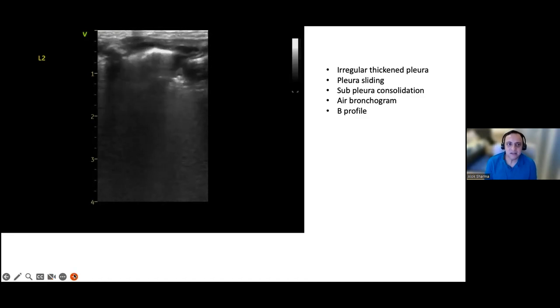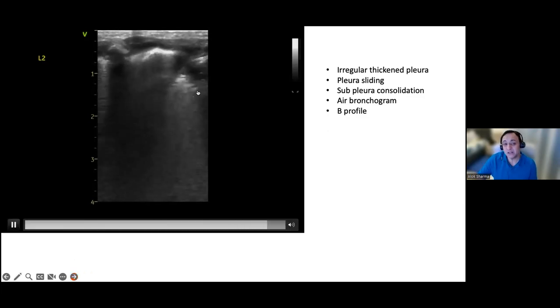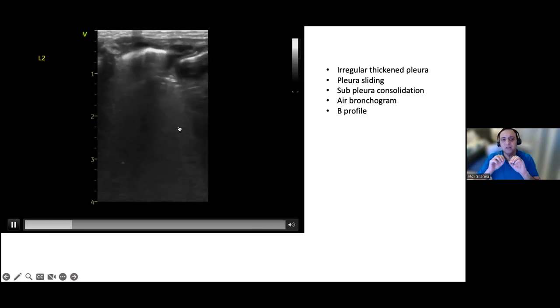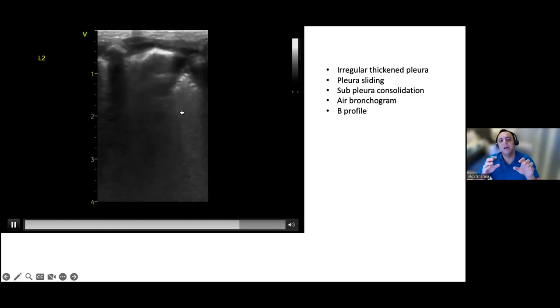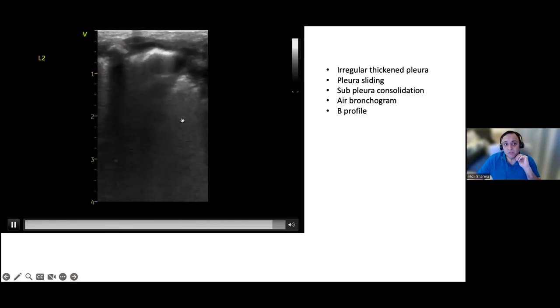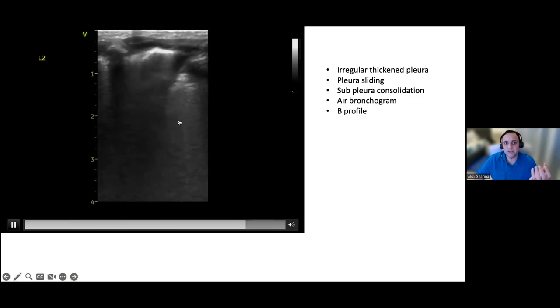Pleural sliding present, but I just think a little bit of lung pulse that you see there. And that's where you'd actually see the shadow of the heart. Folks, very, very important other differential. If you're the person doing the scan, just be careful. The heart comes in that position, and the heart can sometimes give you an appearance like this. But if the heart is giving you this appearance, the pleura should be intact above. So just be aware that the heart can give you a very similar kind of appearance.